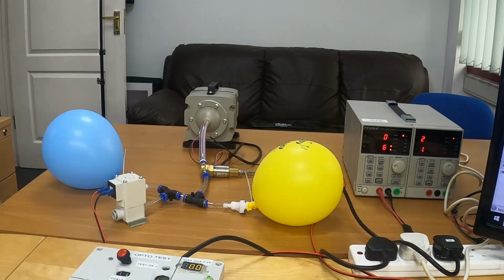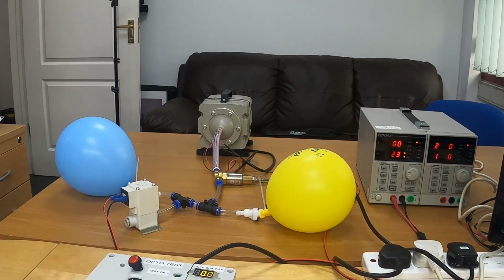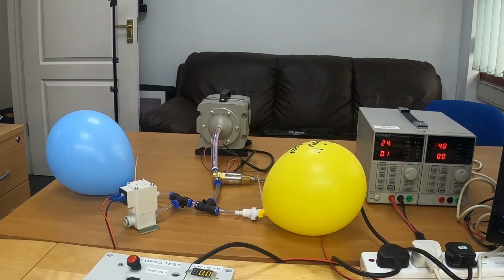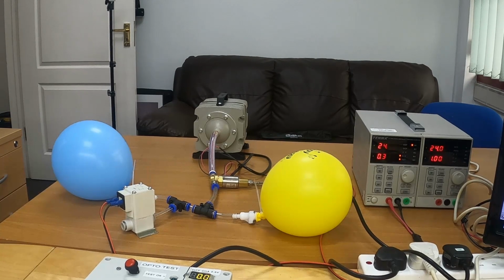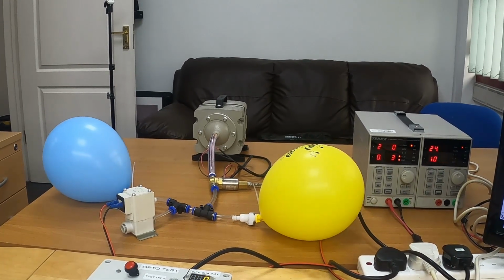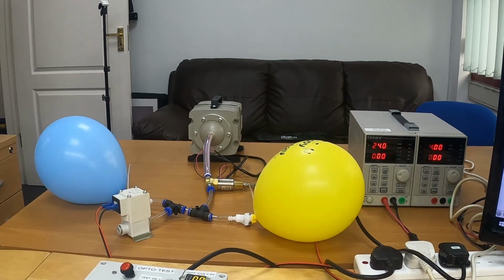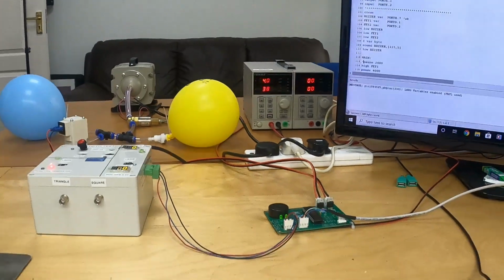So now we change the timings. And this will happily work all day.